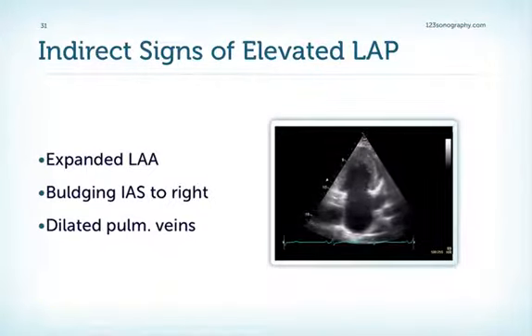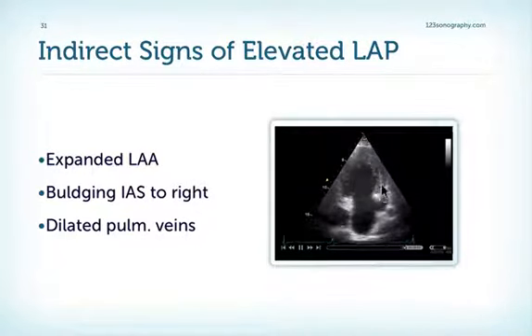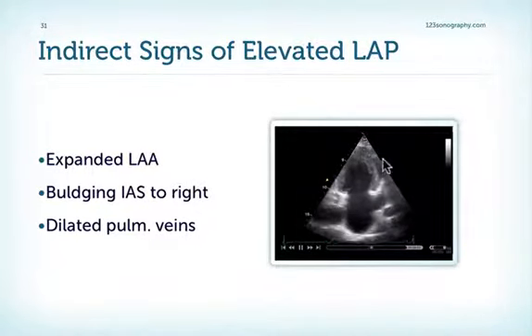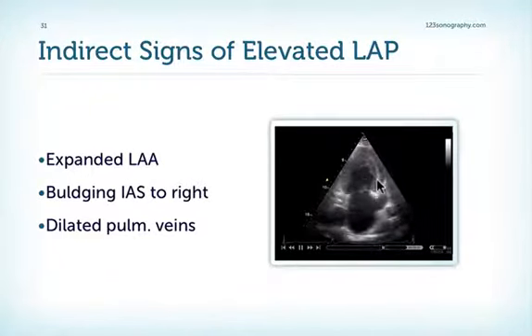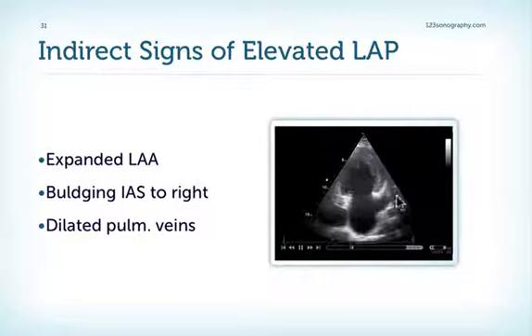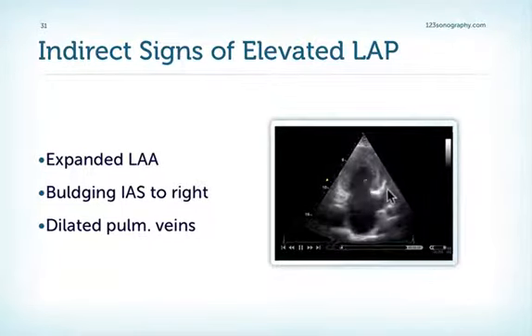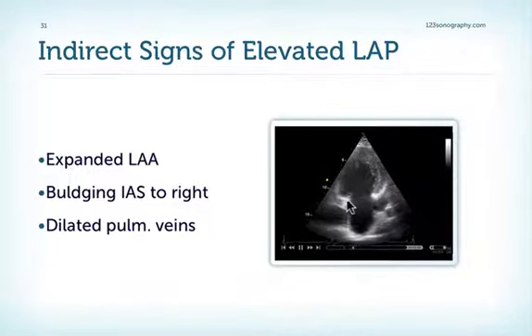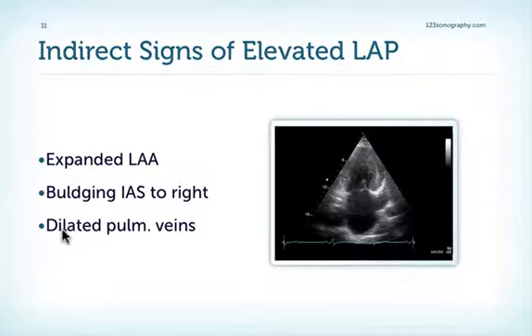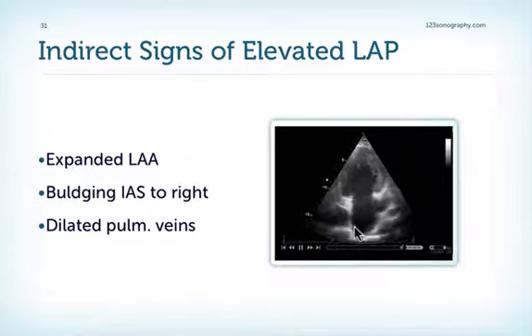There are a number of indirect signs of elevated filling pressure. One is the dilated and expanded left atrial appendage — here is a patient with hypertrophic cardiomyopathy and a huge expanded left atrial appendage, nicely seen in the two-chamber view. Another sign is the bulging of the interatrial septum towards the right. Additionally, you can sometimes see dilated pulmonic veins, visible in the four-chamber view or sometimes in other views.